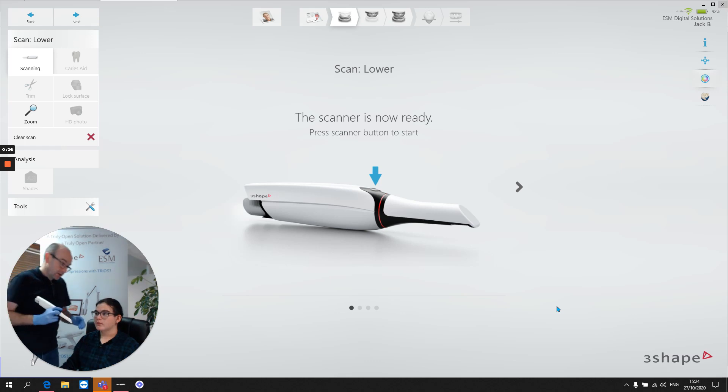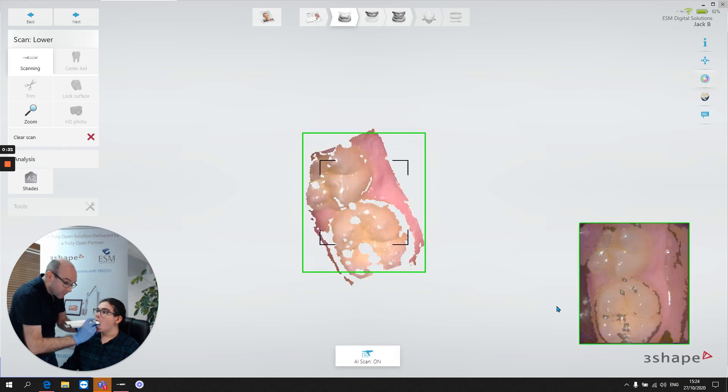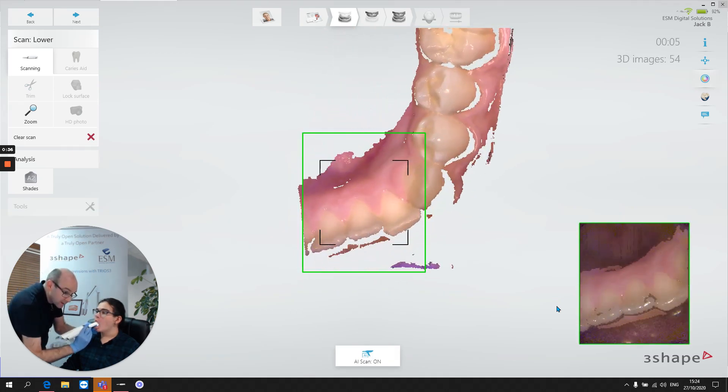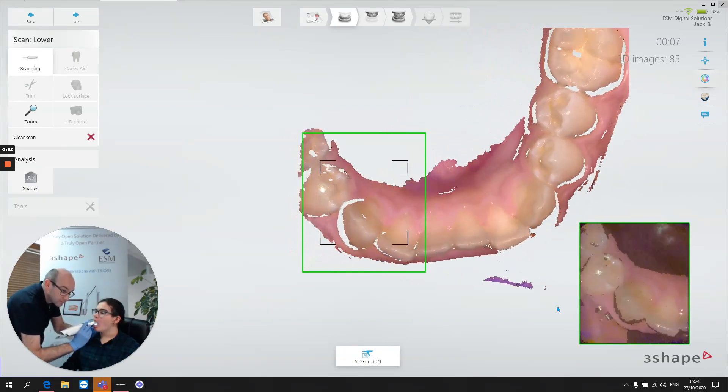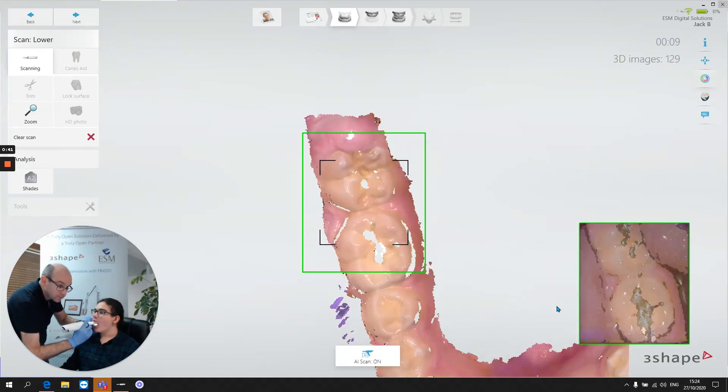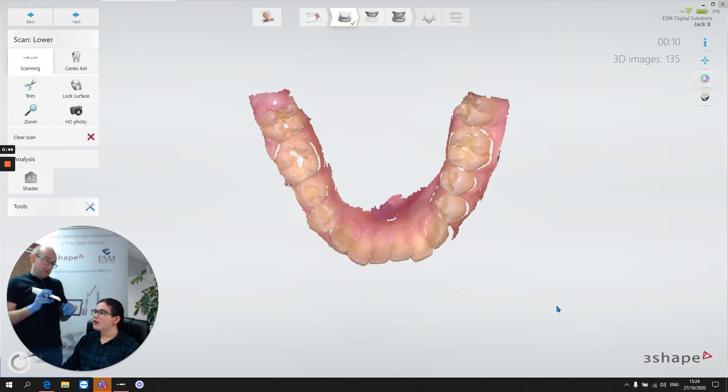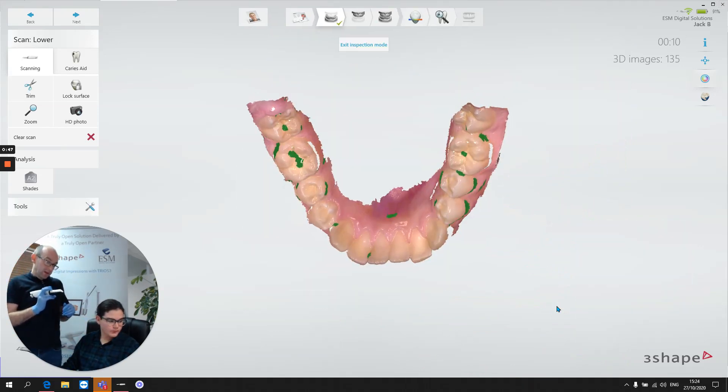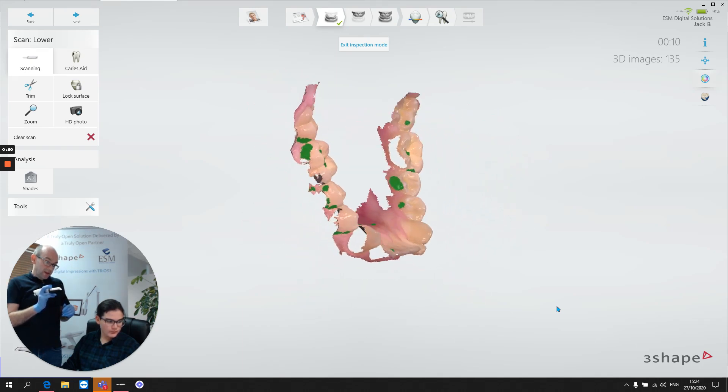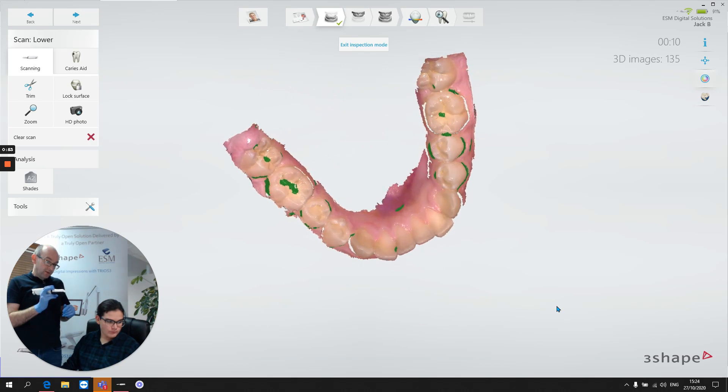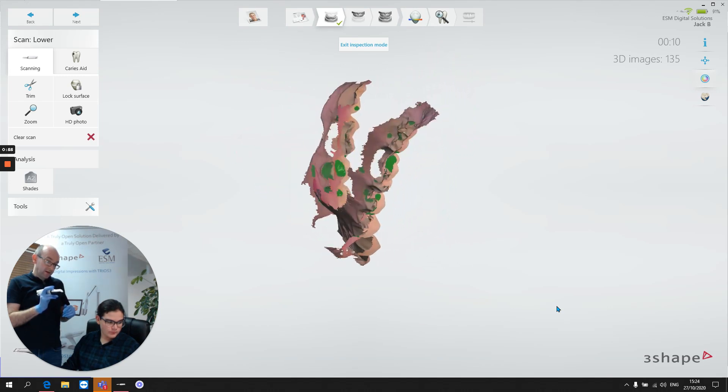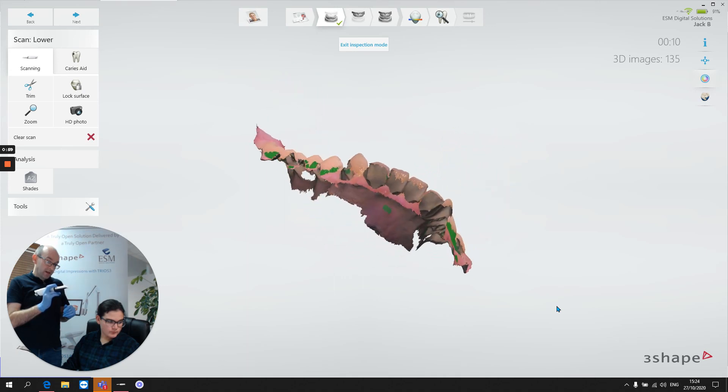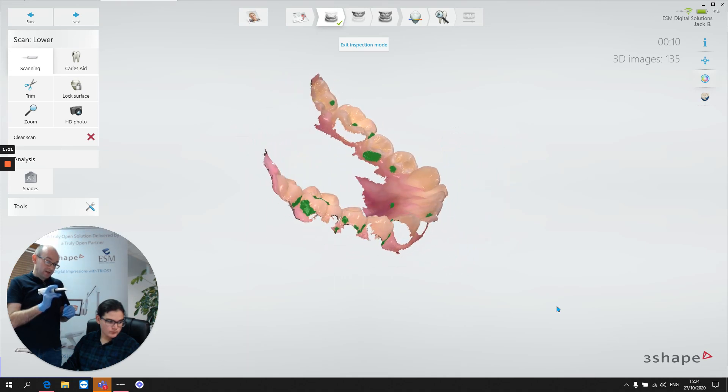Let's start off in Jack's lower arch. If you can open up for me, turn towards me please. Let's start off with a good occlusal scan. We can see that we've captured a nice level of occlusal detail, a nice level of buccal detail, and lingual detail as well. And we have some information there on the incisors.